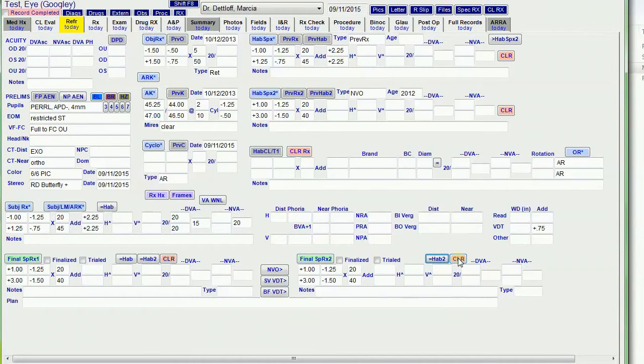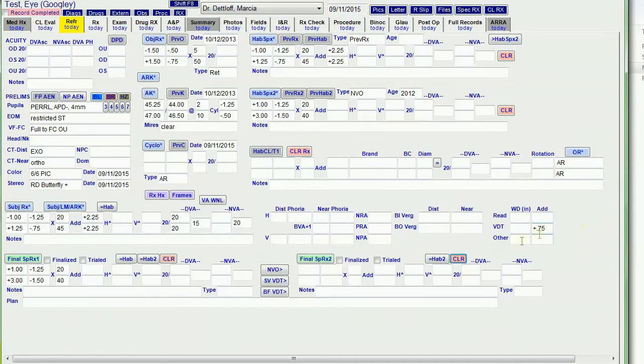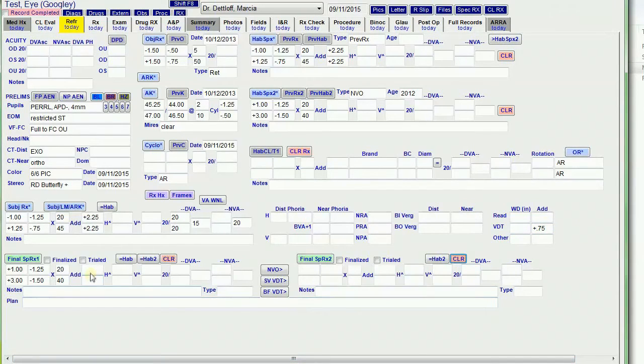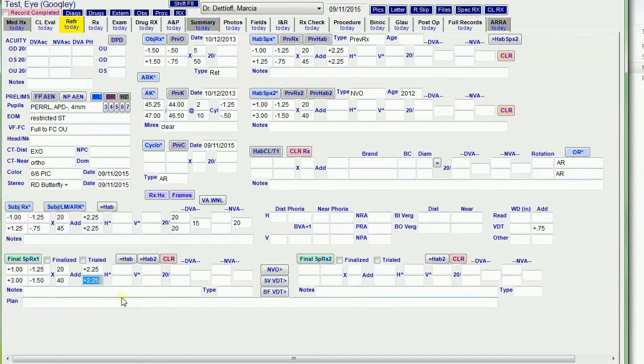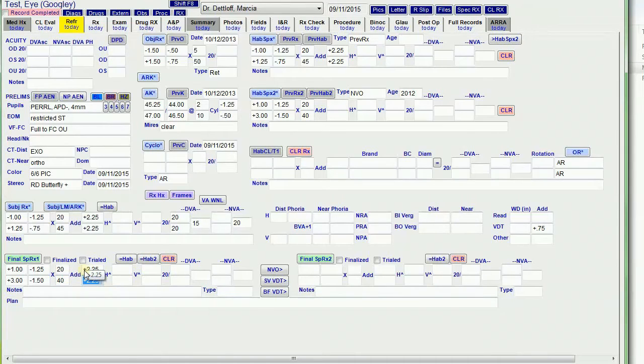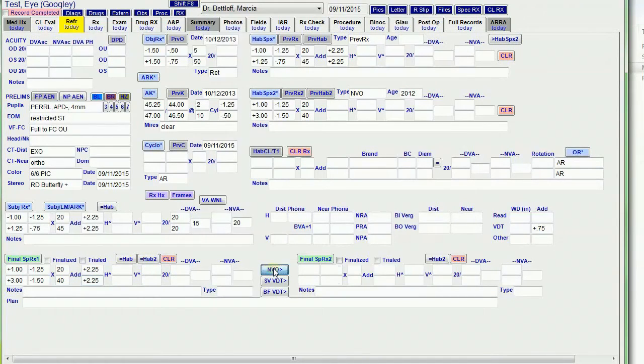But I want to clear that because I want to make some special prescriptions. So actually I need this add in here. Okay, so I've got, this is their basic prescription. And say they want to have a near vision only prescription.